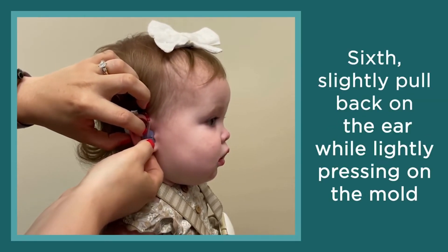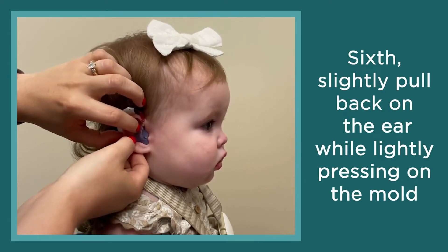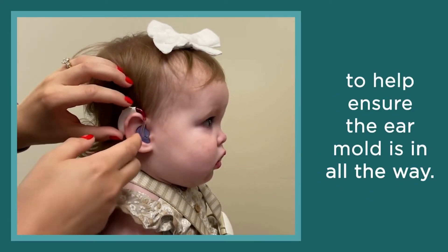Sixth, slightly pull back on the ear while lightly pressing on the mold to help ensure the ear mold is in all the way.